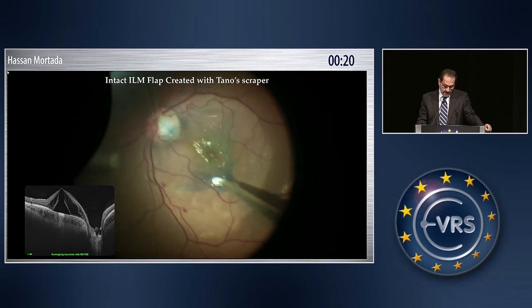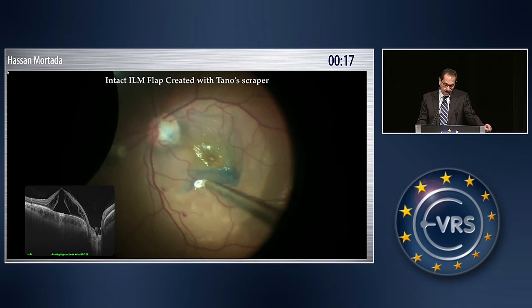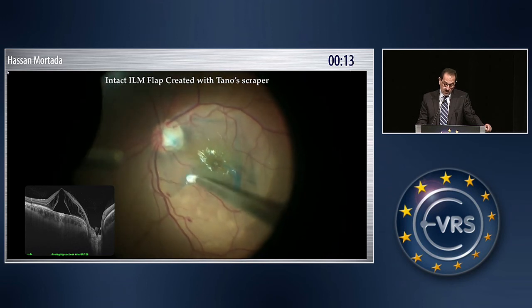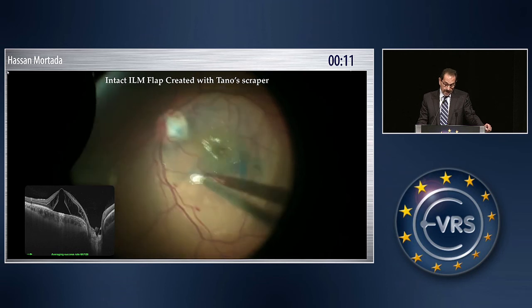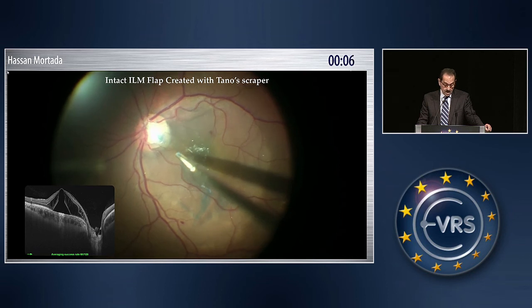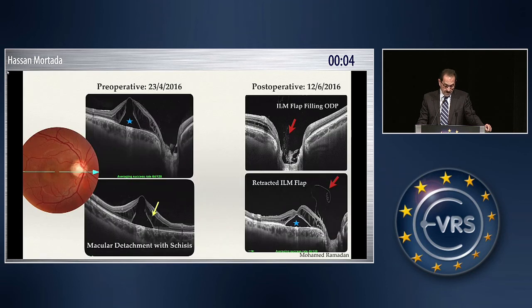This is another case where you can fashion the flap — not with the forceps, but with the Tano scraper. In this case, you have a big ILM flap in one piece. And again, it is stuffed into the optic pit. This is the pre-operative and maybe two months after.